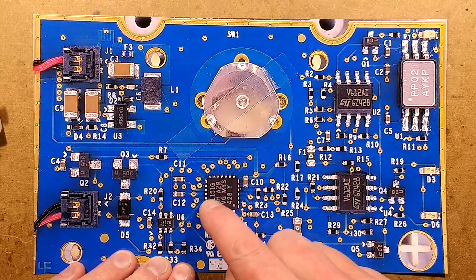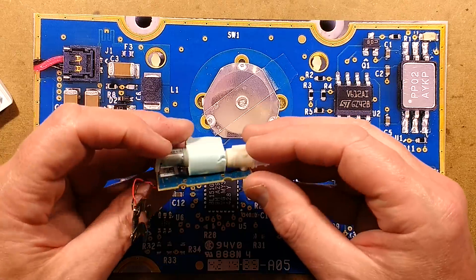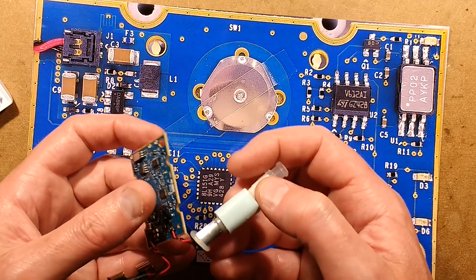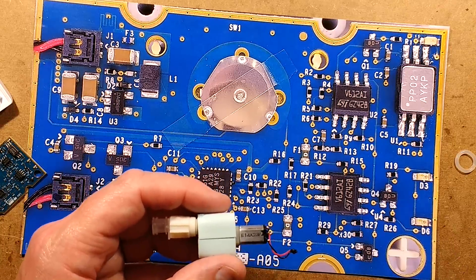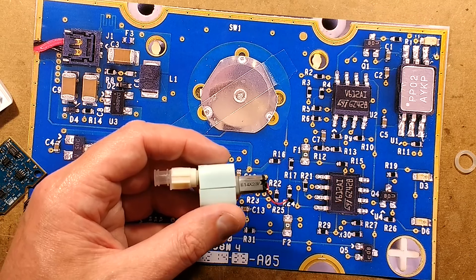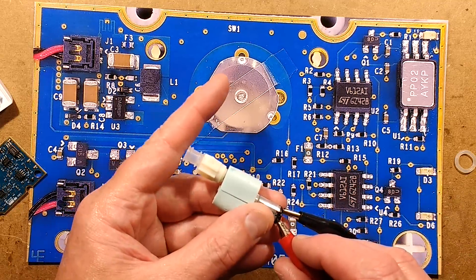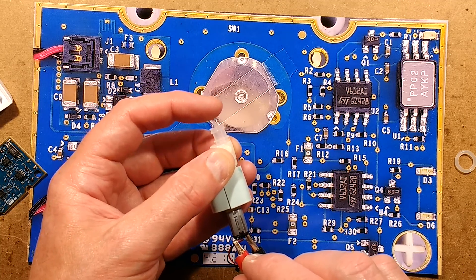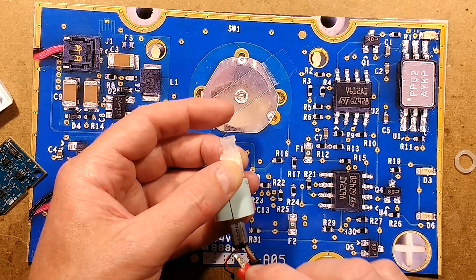It's really what you'd expect - not too sophisticated. It does seem an awful waste for something used briefly, but if it saves a wound getting infected and maintains that sterile disposable hospital hygiene, it's serving its function. The pump is quite interesting - let's power it, give it about two volts. I was trying to pull a vacuum but of course it's got an extra port. Yes, it pulls quite a modest vacuum - a nice little pump.